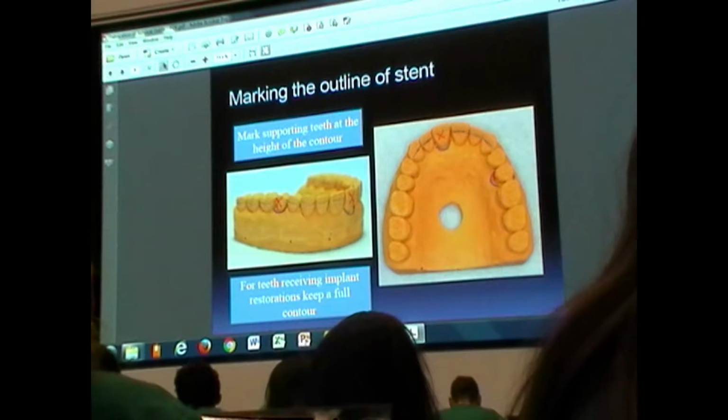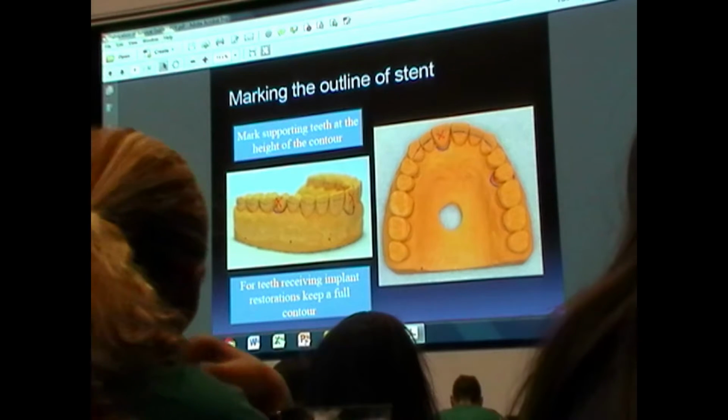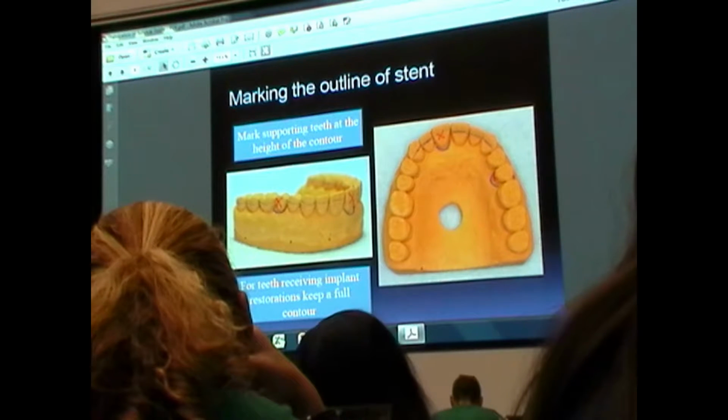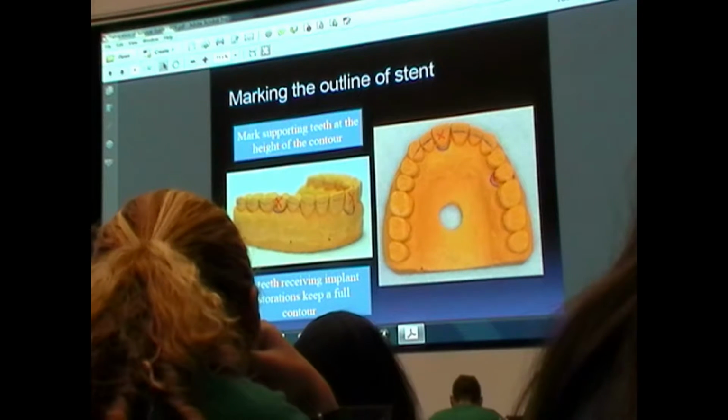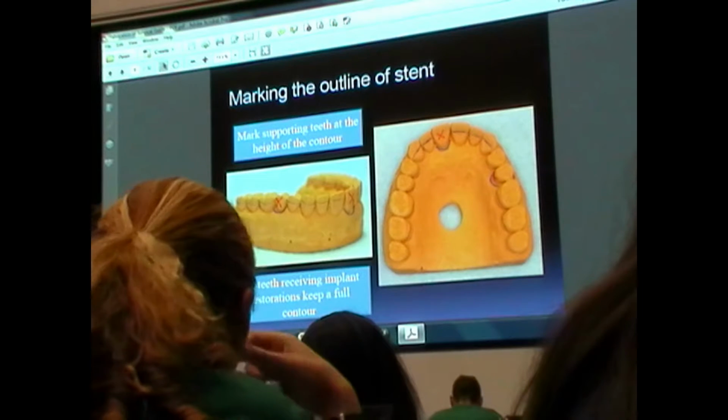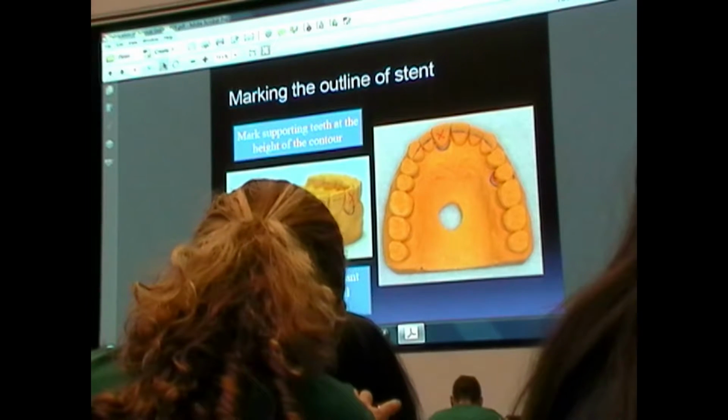If you use a knife, you're probably going to nick the adjacent teeth and knock off the rest of your teeth. So I would probably use one of your lab cutter straight hand piece burrs. For the plaster burr that's non-clogging, but be very careful that you don't take off a nail or cut your hand, all right?